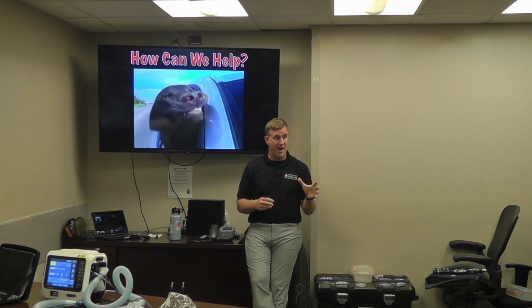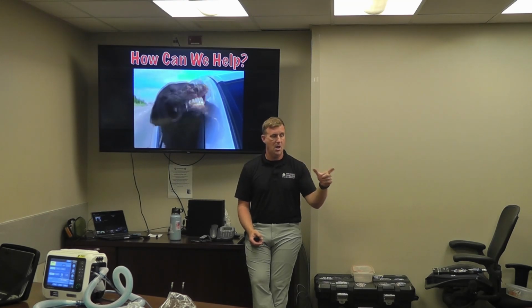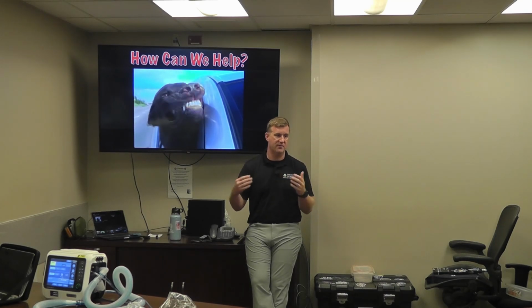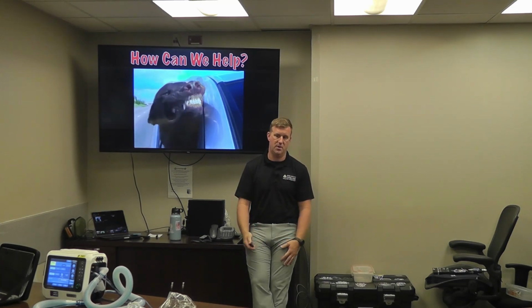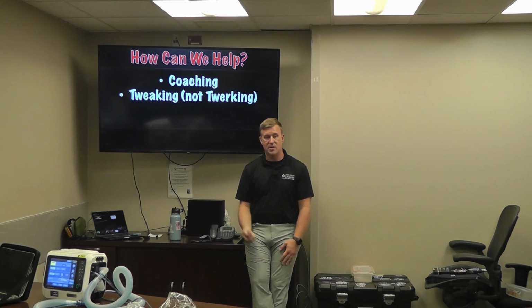For you guys with your pneumatically driven CPAP that you have on the truck, you don't have a whole lot of manipulation. But with a ventilator, if you guys were to get one, there's some manipulation we can do on how we deliver that gas. We can change how quick or how slow, when it gets delivered, when they exhale, those types of things. And we'll talk through that on the ventilator here in just a second. So we've done our coaching, and then we can do some tweaking on the ventilator.